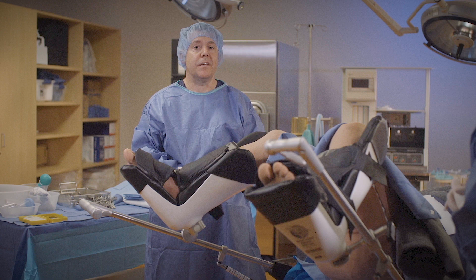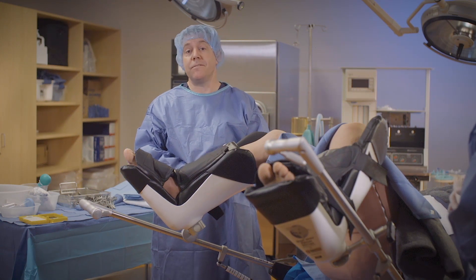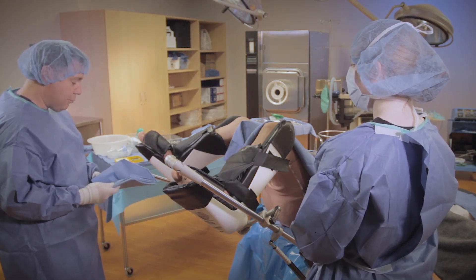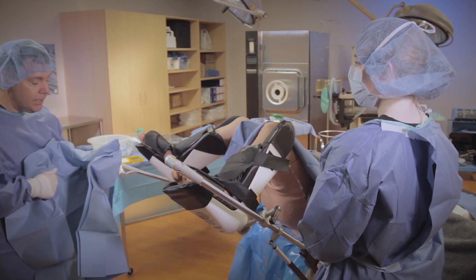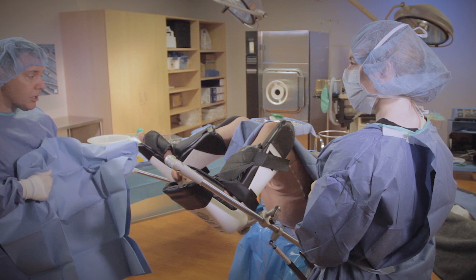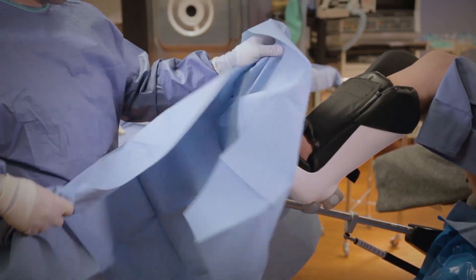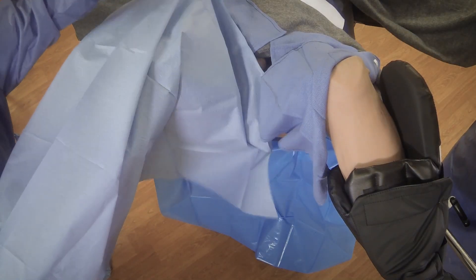The companies and manufacturers that make these drapes make it as easy as possible. They label the direction of the drape, the side it's supposed to be on, and oftentimes the anatomy it covers. On the leggings it says left hand under the cuff and toe. So I'm going to follow those directions and put my left hand under the cuff, grab the toe with my right hand, and let the drape drop. It's incredibly easy to not put this drape on correctly, so we want to start really carefully and take our time to be sure we cover the whole stirrup. I'm going to go under the cuff, create an opening, and slowly put the drape onto the stirrup — staying behind the cuff and pulling the toe — then extend it onto the patient.